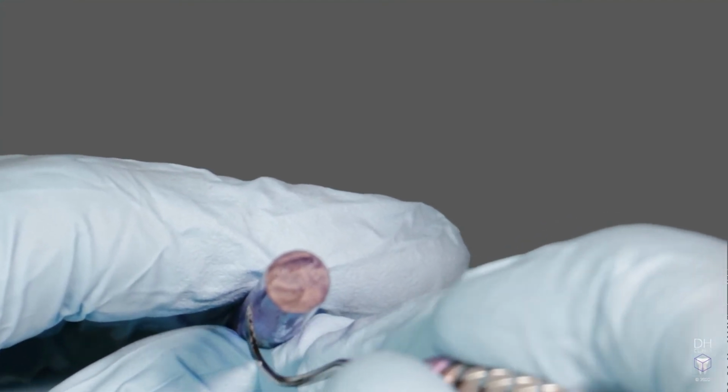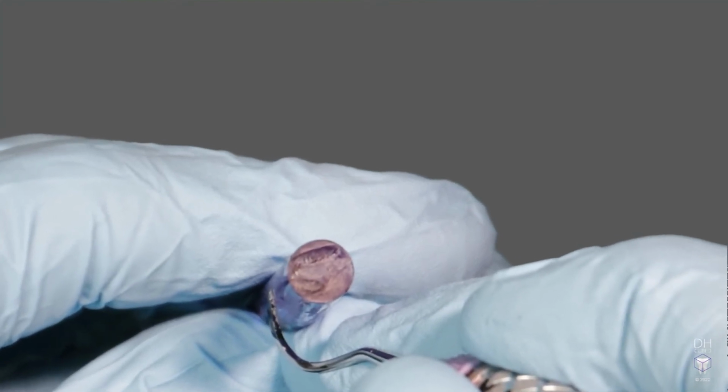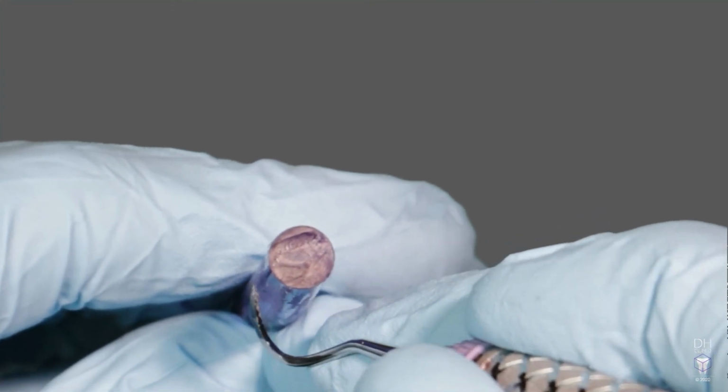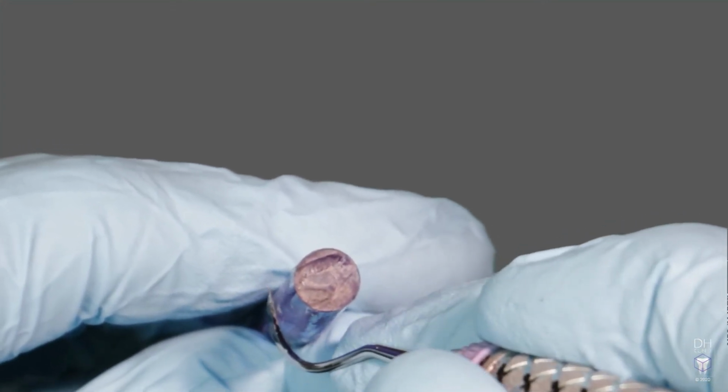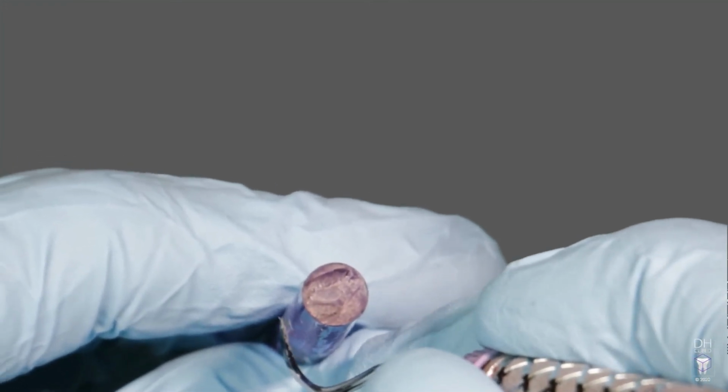You don't want to make the mistake of only sharpening the dull section of the blade. This will, over time, alter the original shape. When you have a dull area, you must sharpen from the shank to the tip in order to maintain the original design of the instrument every single time you sharpen. It can't be emphasized enough.